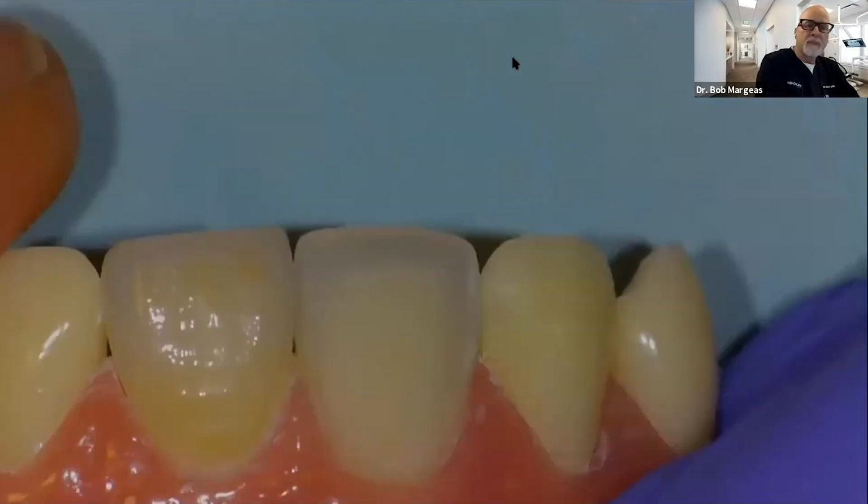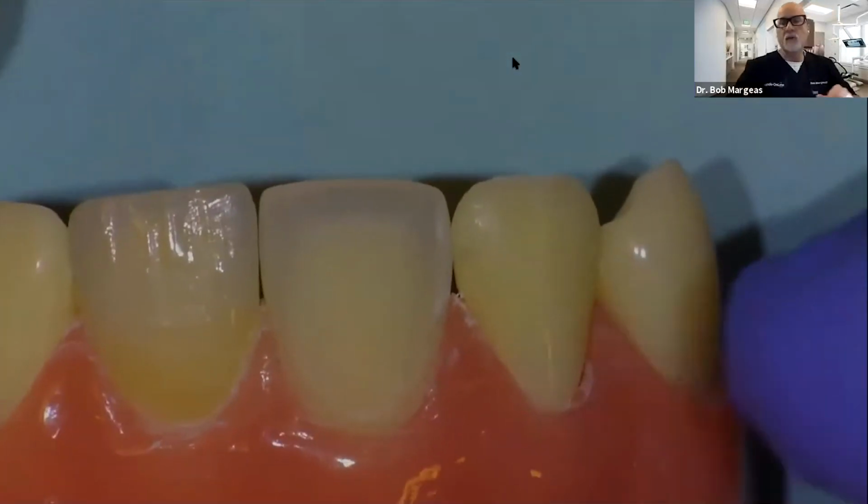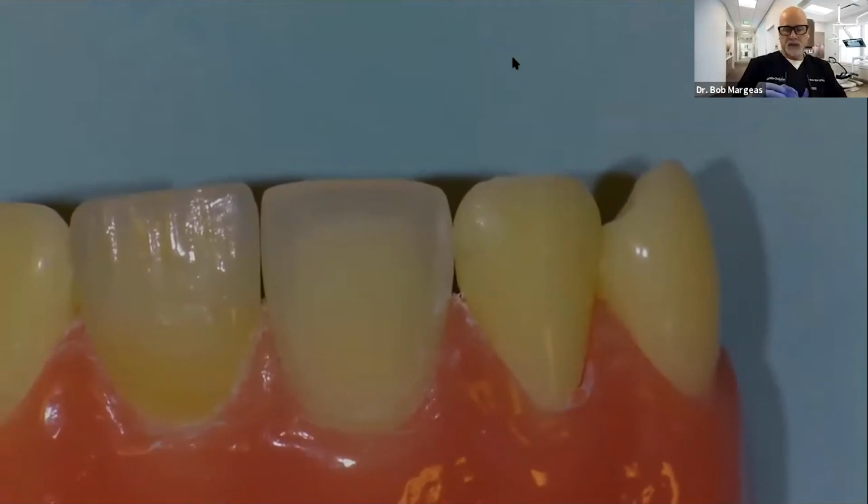And so I want you to be able to follow along step by step so that you will be able to recreate this in your own office. I'll go through some of the materials that I used, and we'll talk about different materials, different instrumentation. You know, because as a speaker, do I have my opinions and biases? Yes, I do. I'm biased towards what I use in my everyday practice. And I use a lot of composite in my practice.